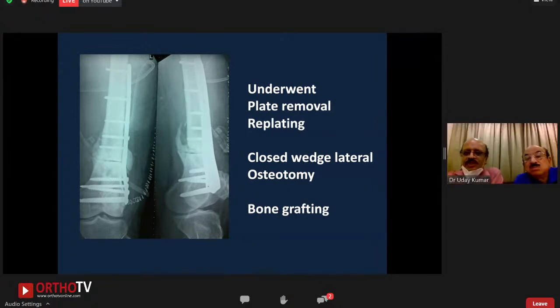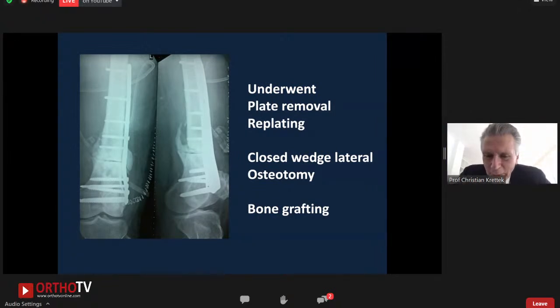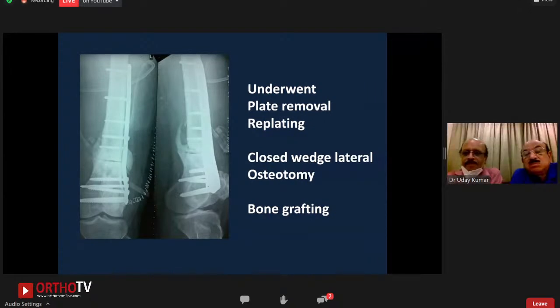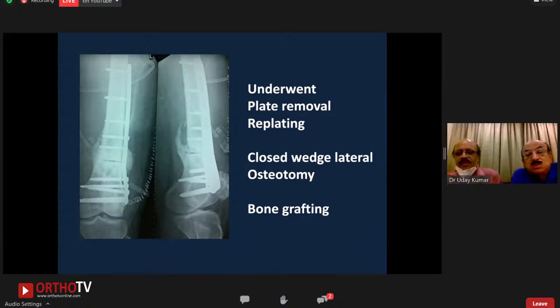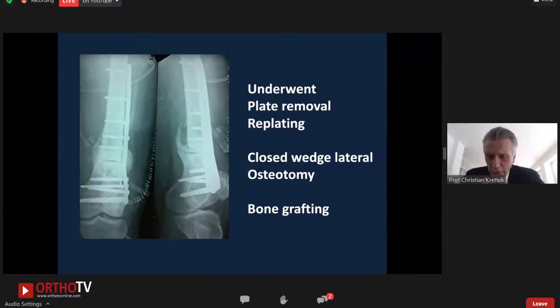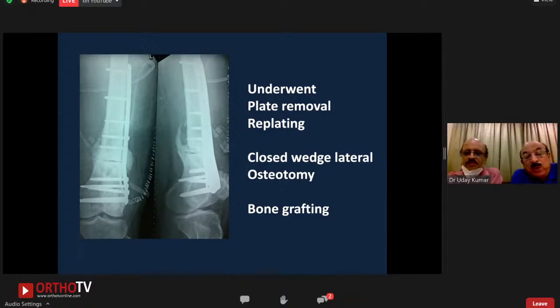Professor Krettek, any comments? Yeah, in terms of bone grafting, I would use part of the bone graft after the osteotomy. Then I would go in with a lamina spreader, slightly opening it, and insert the first portion of cancellous bone through the osteotomy to the medial side, because once you have closed the osteotomy gap, you don't reach the target area anymore without further compromise of soft tissue. So in the fracture site, to increase the vascularity, is it wise to drill some holes there?